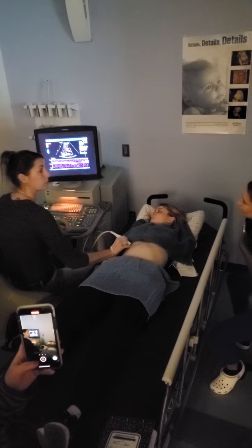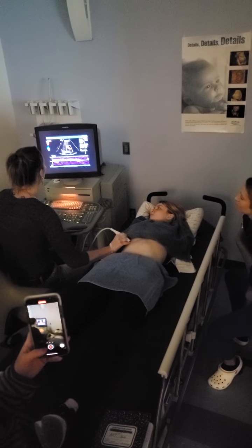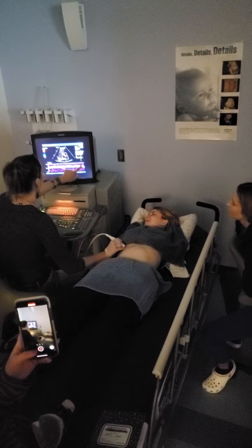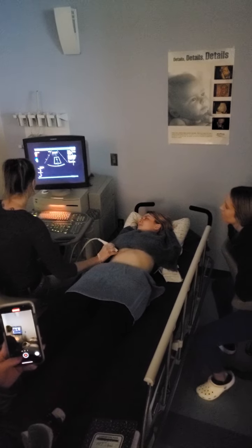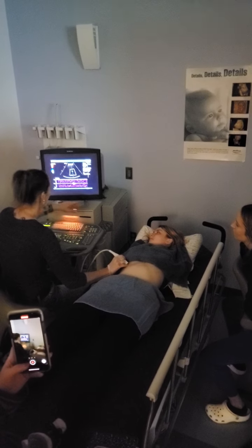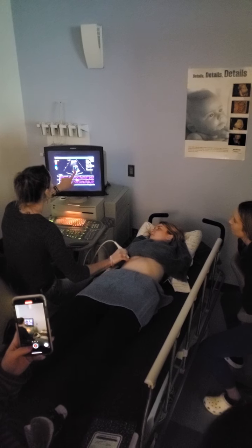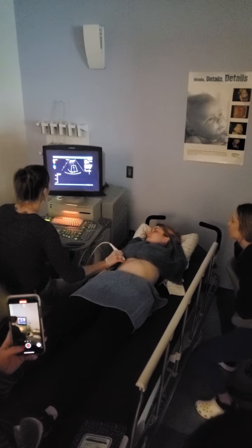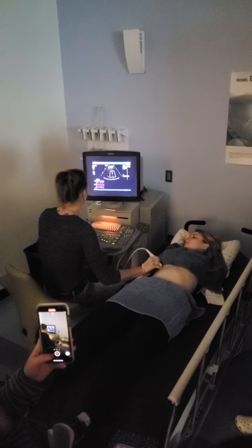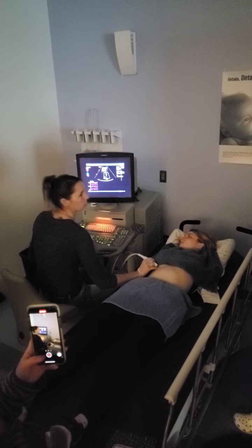You guys are only responsible for the color this quarter, but here's what our spectrograph would look like. It would be hepatopetal flow above the baseline. The other thing we can do on this is, oh man, what am I imaging? There's three ways to update. I can update here, it will make this go live again. Or I can update with these down here. Or there's an actual update button right here. It makes this live, so you're not just guessing what you're looking at.